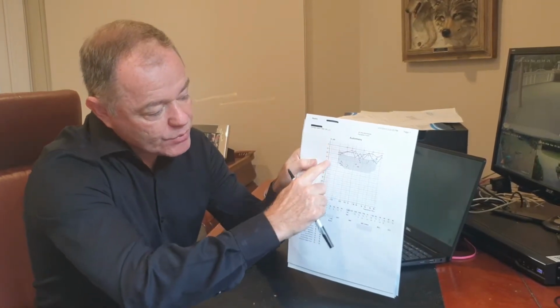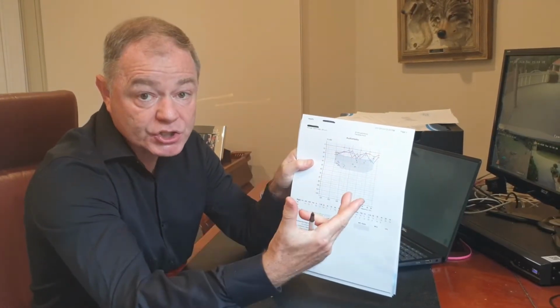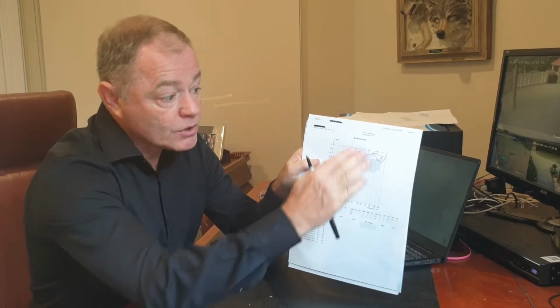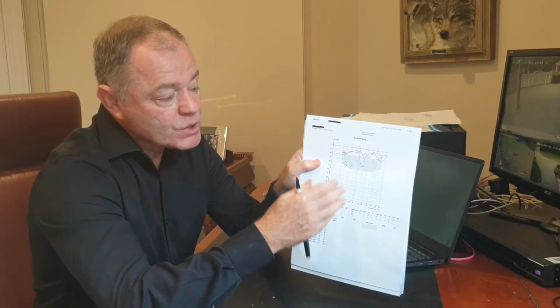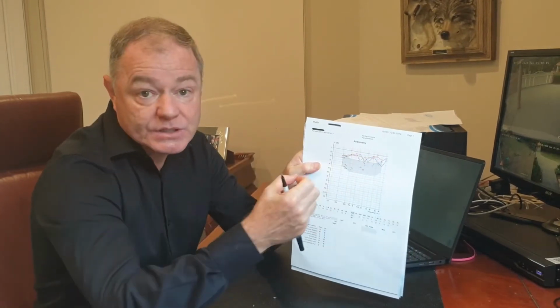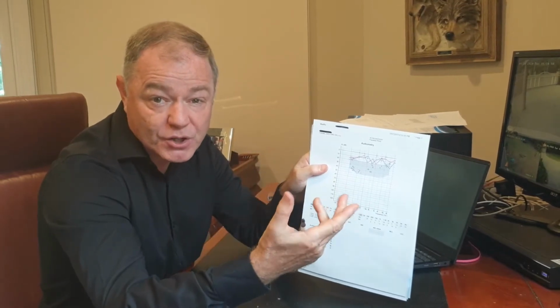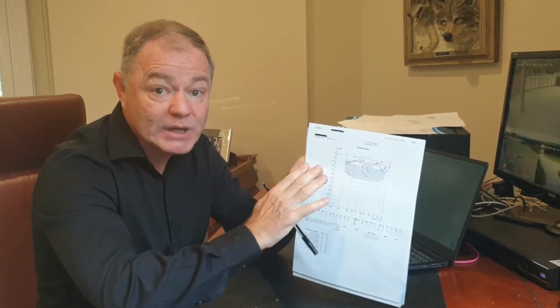So as we go down, it represents the loss in decibels, and as we go across this way, the sounds get sharper. So it's like a keyboard on a piano. The tones over here on the left are very deep, over on the right they're much sharper. So in terms of speech, the deeper tones will be sounds like ah, oh, ma, ba, da, and the high frequency sounds will be s, f, t, ch. So they'll be the much sharper sounds. Now, as far as speech is concerned, all the sounds are important. It's important that you hear the full speech spectrum. Whenever part is missing, that's when you're going to start to have issues.